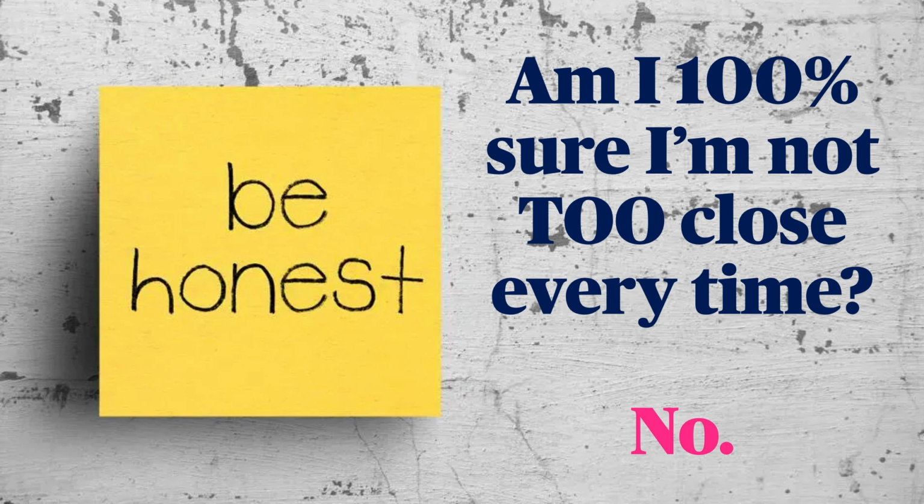About once every couple of weeks, a trainee will be advancing the needle across the screen, and the needle is coming up into the plane and out of the plane and into the plane and out of the plane, and I'm not sure 100% of the time where the tip is. So I'll turn the current on, set it at the foot of the bed, and forget about it. And I'm looking to not get a twitch. So if I do feel a twitch, we're like, whoa, whoa, whoa, everyone stop. Let's pull the needle back and figure out where we are.